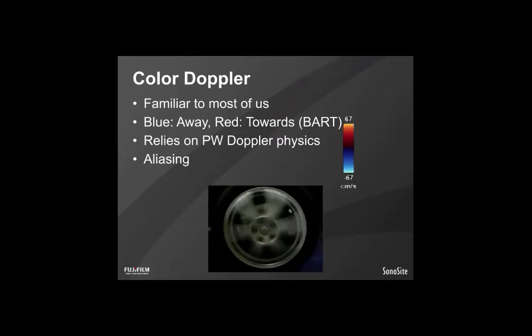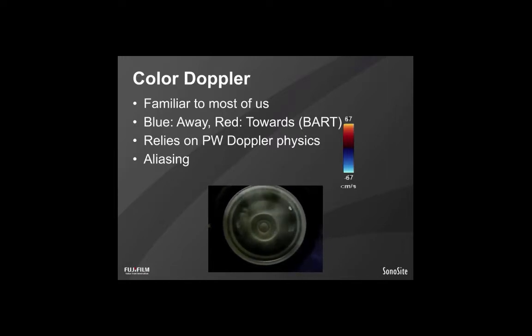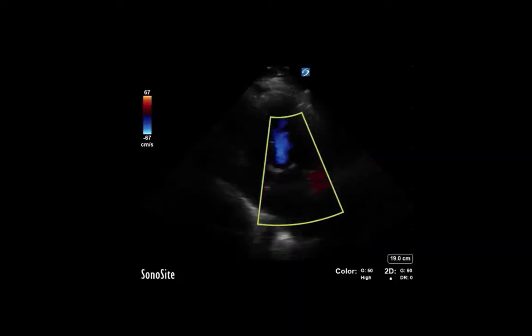And so this idea that sometimes the speed of our resolving object, in this case a video camera, in our actual case that we're discussing in this tutorial, an ultrasound machine, can be exceeded and provide misinformation, is really at the heart of aliasing. And we'll come to real examples of this in echo shortly.